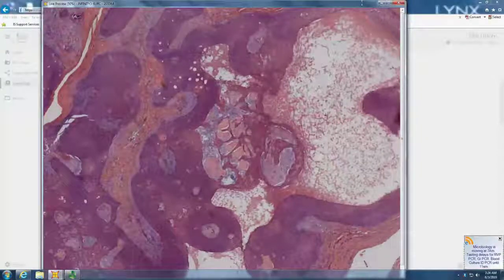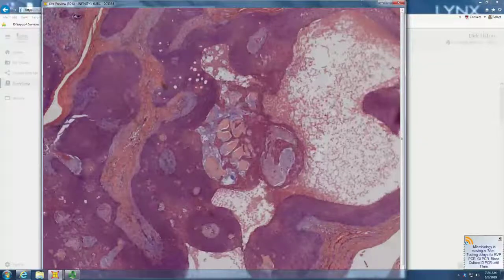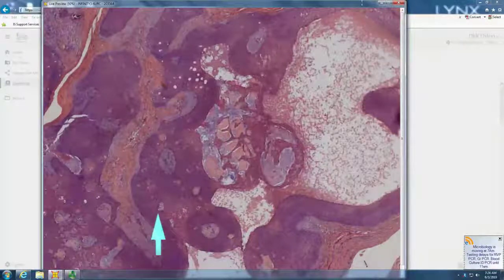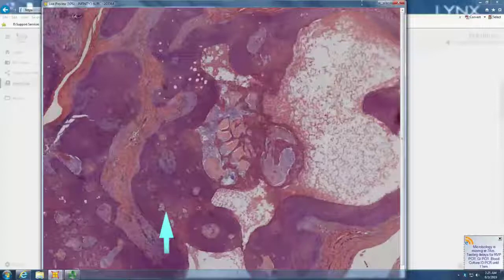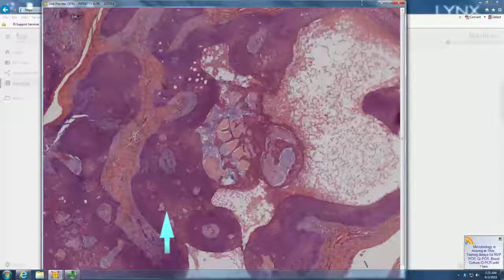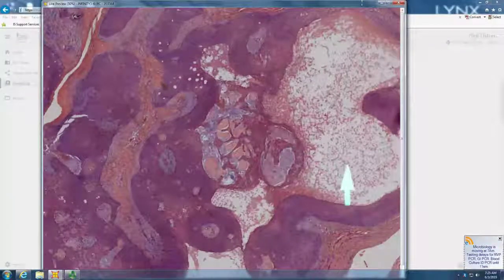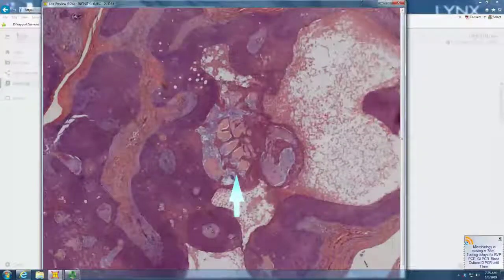What they have in common is they're made of cells that differentiate towards the acrosyringium. They have visible pink cytoplasm, whereas the ones that differentiate towards the secretory portion have just nucleus, no cytoplasm. They have ducts. They never palisade. They often have cystic degeneration. And they have the characteristic poroma stroma.